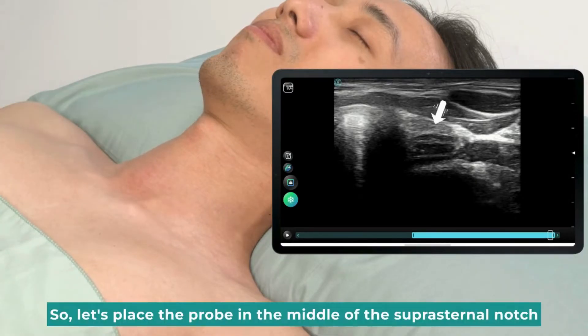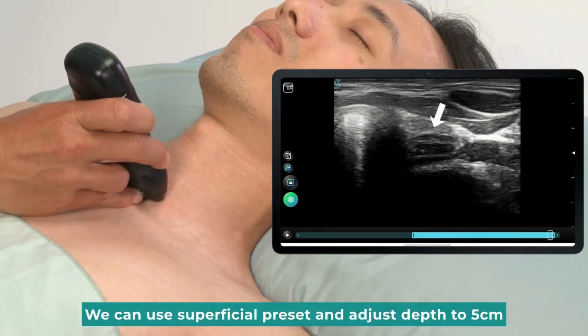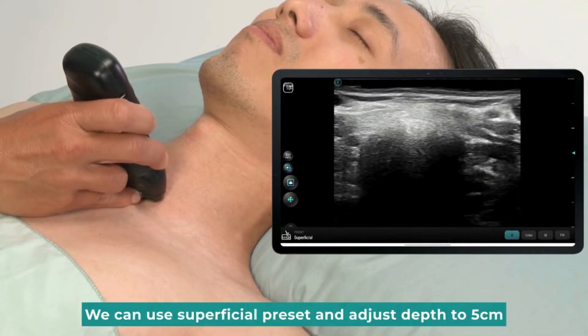So, let's place the probe in the middle of the suprasternal notch. We can use the superficial preset and adjust depth to 5 cm.